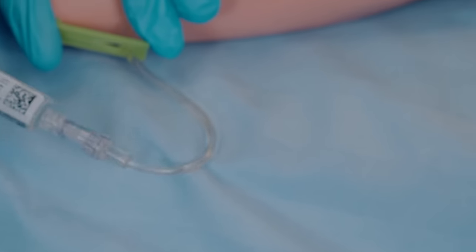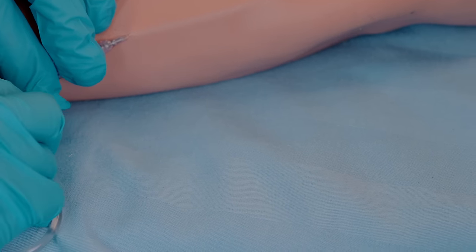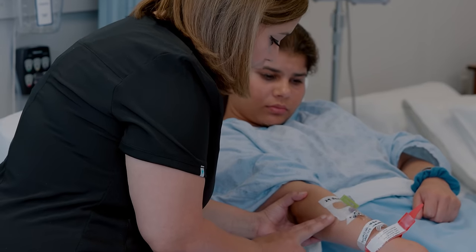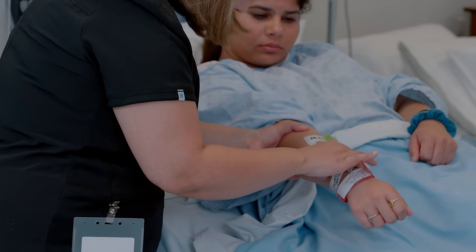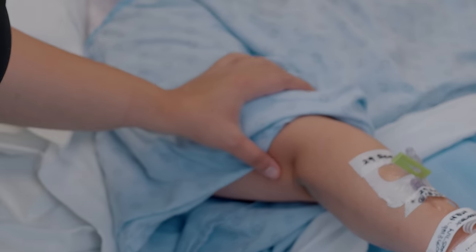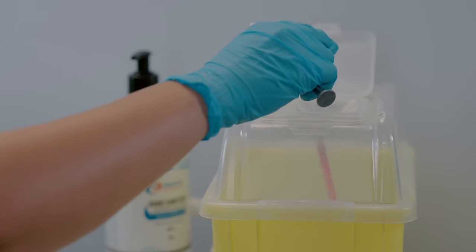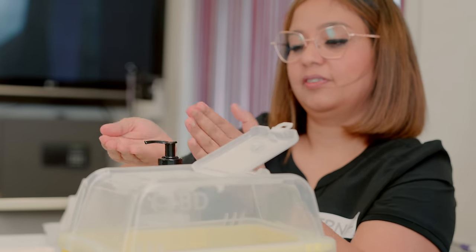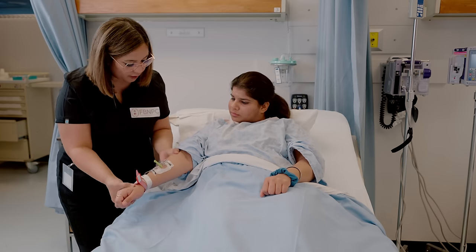You can also follow your agency policy and attach a saline lock to your IV cannula, but make sure the saline lock is already primed with normal saline and ready to go. Once the cannula with the saline lock is in place, fill a syringe with saline — or use pre-filled syringes — to flush the cannula and check its patency. If there is any resistance or pain, check for localized tissue swelling. If present, immediately stop flushing, remove the cannula, and start again. Dispose of gloves and equipment in the clinical waste bin, ensure the patient is comfortable, perform hand hygiene, document the procedure, and do a follow-up check.